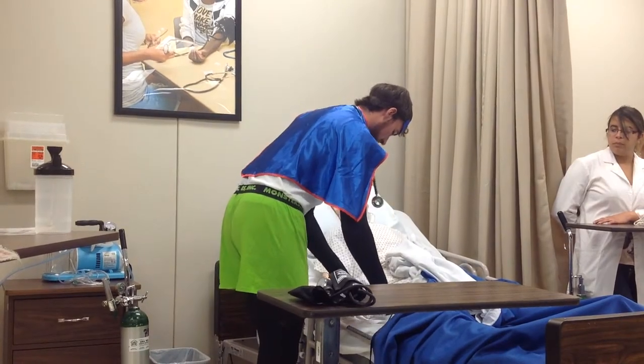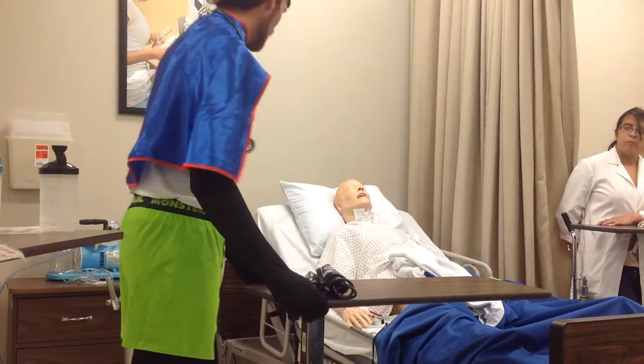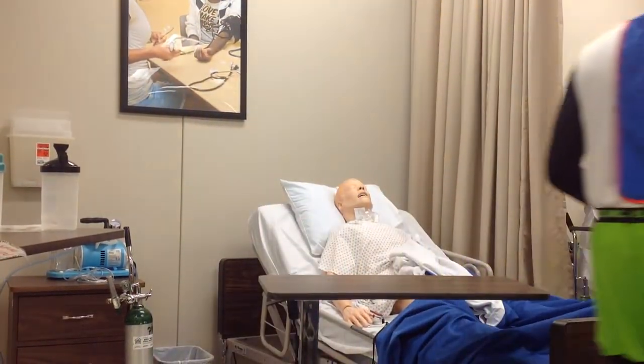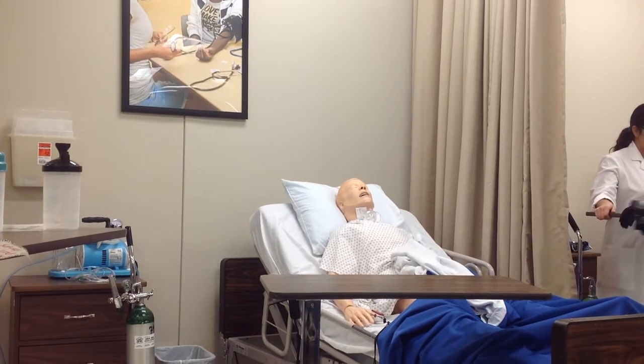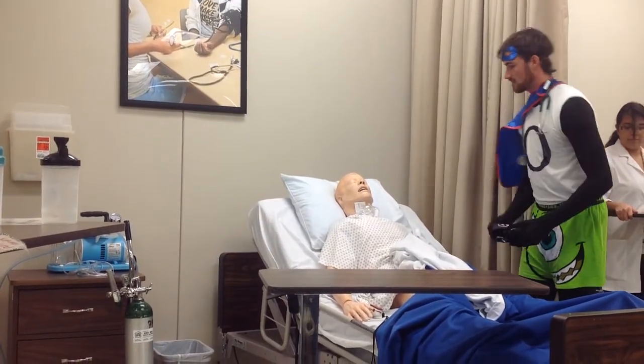On this pulse ox, his O2 sat is 87, and that's abnormally low. We want to try to keep that O2 sat at least over 92, so now we know why we're probably giving him oxygen.